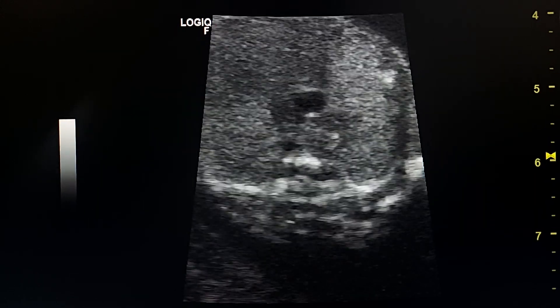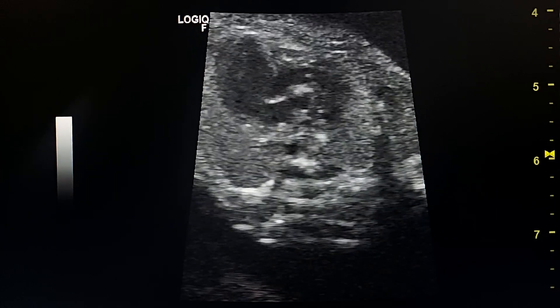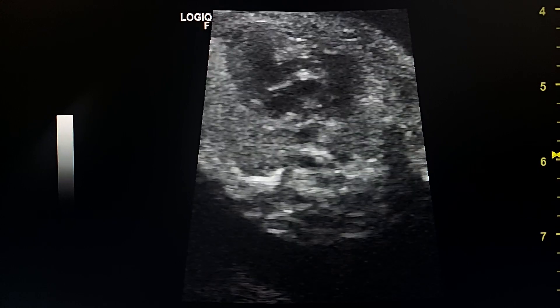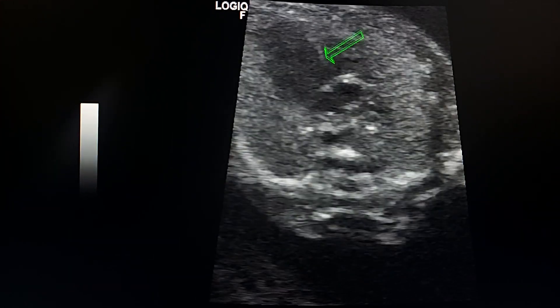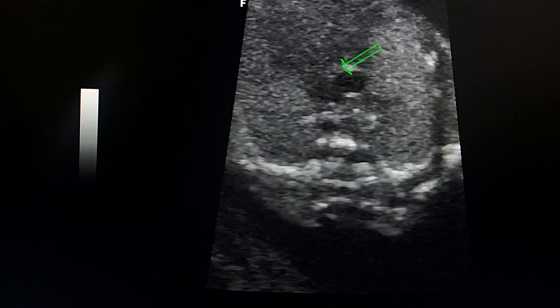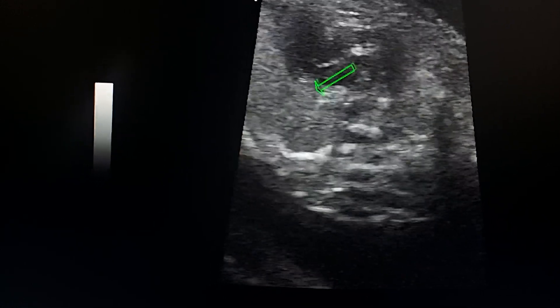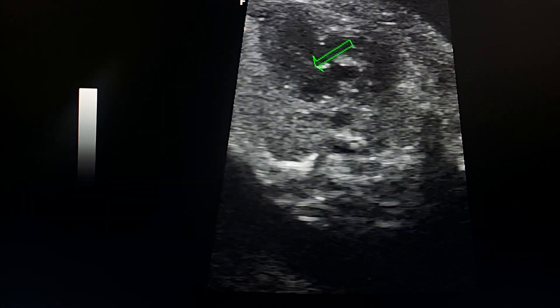This is a more clear loop. This is the VSD between the two ventricles. Normal-sized left ventricle, small-sized right ventricle, atretic tricuspid valve, normal mitral valve.